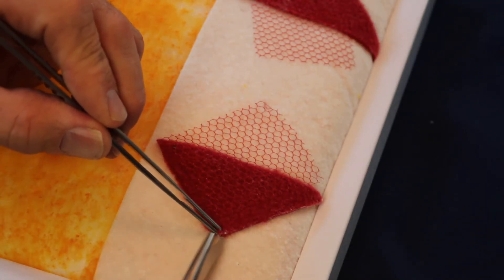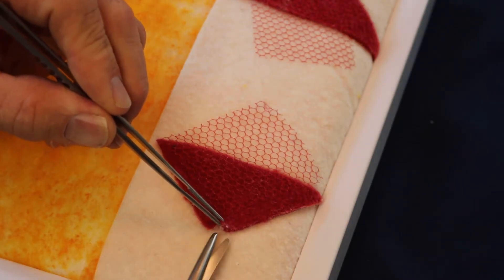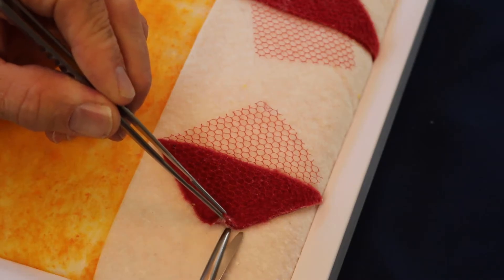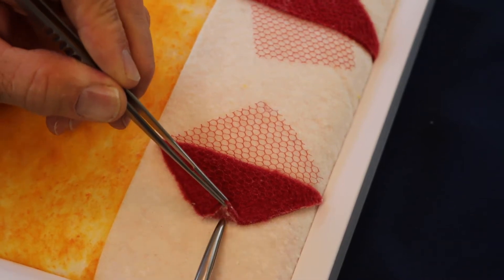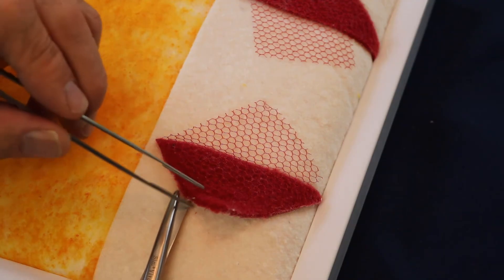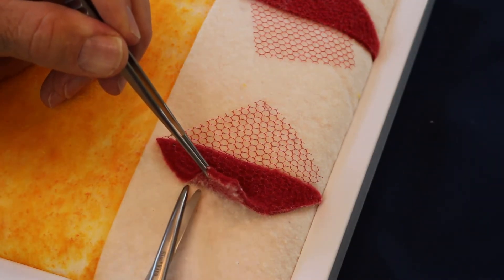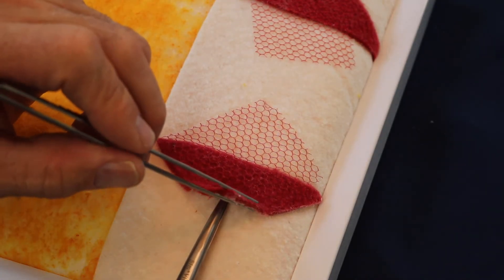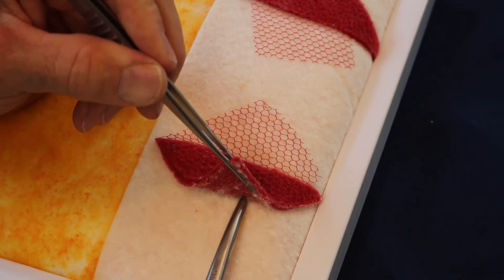Sometimes the tissue planes will be soft and fairly free. If this is the case, the scissors can be used in a spreading motion to continue the separation. If however the tissue plane is tight, then small cutting strokes are preferable. As you continue the removal of one simulated tissue from another, you should grasp as close as possible to the region that you are cutting or spreading to allow the greatest amount of traction to be applied.